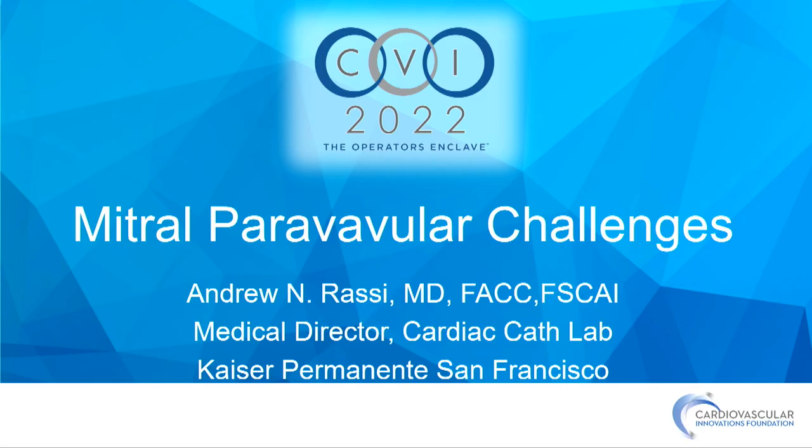I tried to get inside Paul's head and wonder what he wanted me to speak about when he wanted me to talk about mitral paravalvular challenges. So I thought first about a case where I put in two MitraClips and I had a big central leak, and we ended up having to plug that with an AVP, and I realized that's not paravalvular necessarily, but I learned that from you from this conference, actually. I tried to imitate what you did.